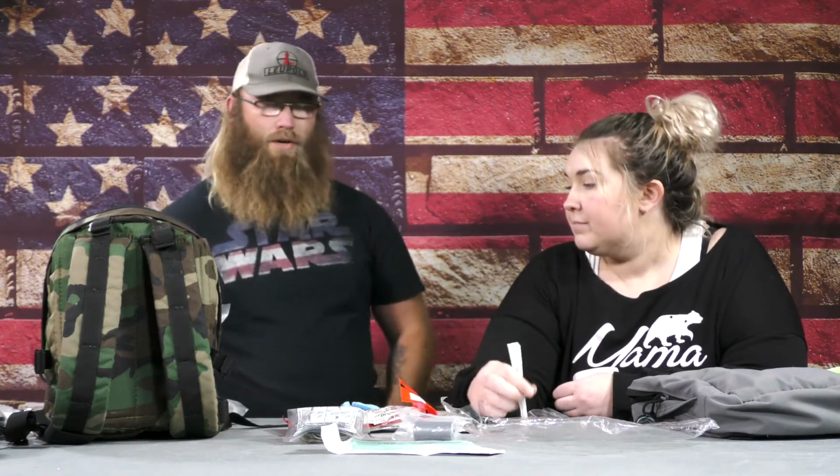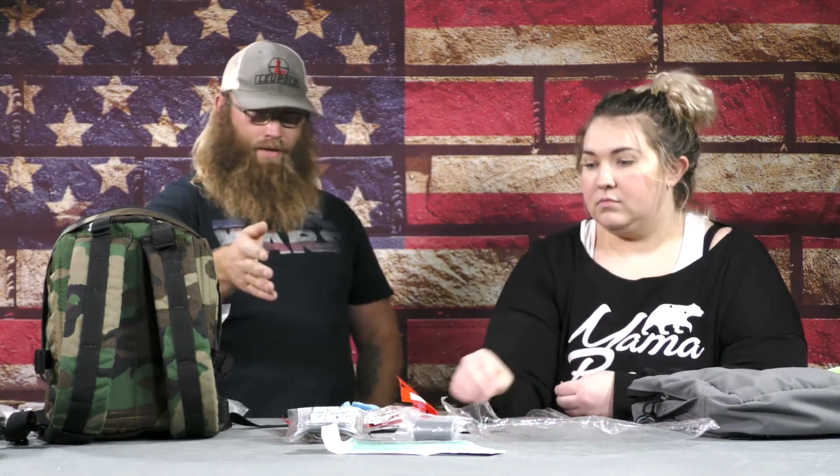So basically, because people always ask me, "I need a medical kit. What should I get?" This is the one I'm telling them to get. If we're going to add to it, I think we would both say the first thing should be a second tourniquet, right? And chest seals.